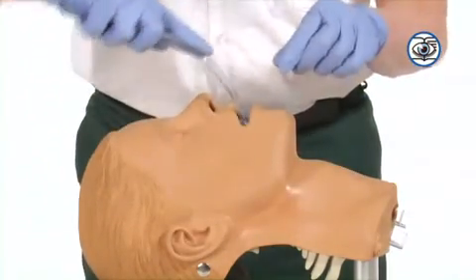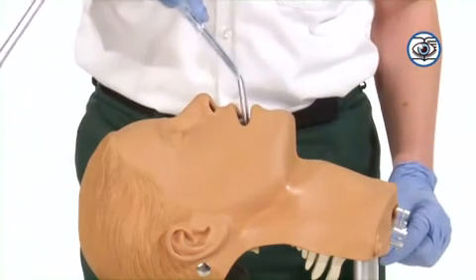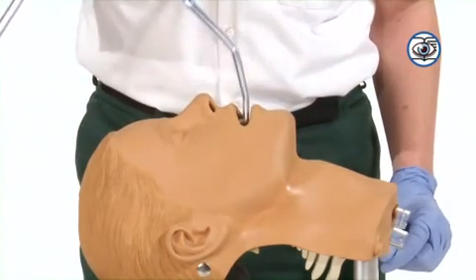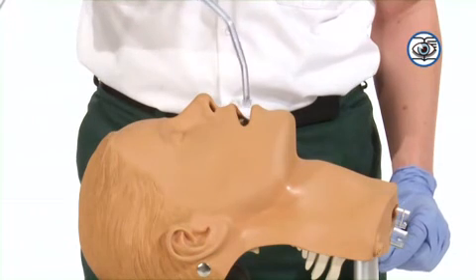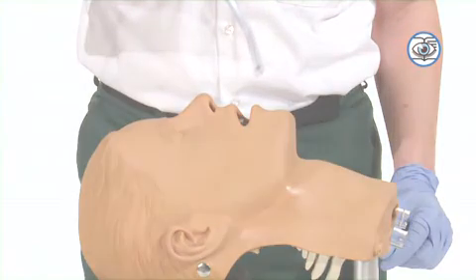Catheters often have a vent hole, which allows suction to be applied once the hole is occluded. The catheter should be inserted in the suction off mode and only switched on as the catheter is withdrawn in a spiraling action. Prolonged periods of suctioning, that is greater than 10 seconds, should be avoided.